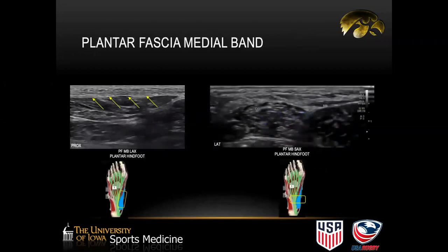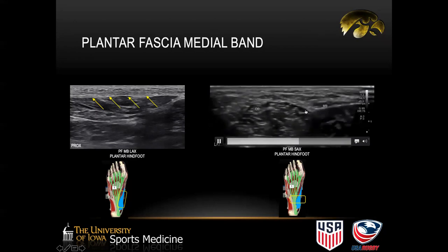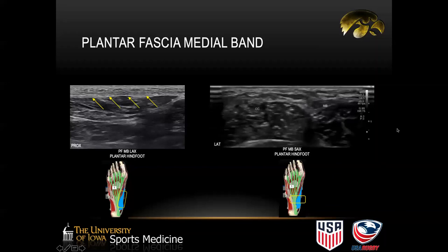Regarding the medial band of the plantar fascia — I personally have not seen pathology in this region. It's the fibrous tissue that branches out medially and covers the abductor hallucis. You can see this hyperechoic structure fanning out medially in this cine loop. For this patient, the medial band is normal, and because I haven't really seen much pathology here, I don't often comment on it extensively.